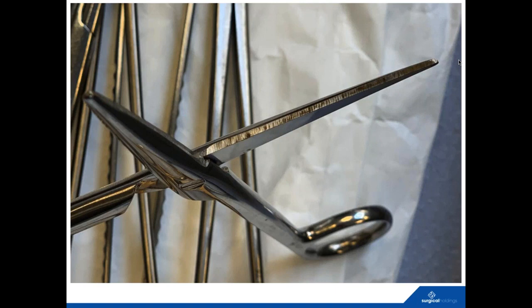But you've got to know what you're doing when you're repairing scissors, and not just know how to sharpen it, but know also how the scissors are actually going to be used and in what circumstances, because with this sort of thing, Bob, you're potentially harboring bioburden, because how are you possibly going to ensure that's clean along that edge?